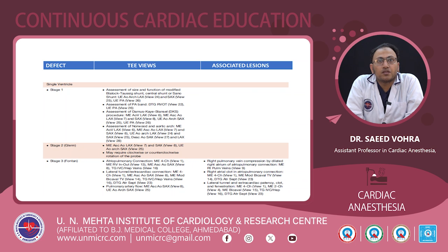To assess the DKS procedure, the mid-esophageal aortic valve long axis view and mid-esophageal ascending aorta long axis view and short axis view will be helpful. For the assessment of the Norwood and aortic arch, the mid-esophageal aortic valve long axis view, mid-esophageal ascending aorta long axis view and short axis view, and upper esophageal arch long axis and short axis view will be helpful. In stage 2 BDG patients, the mid-esophageal ascending aorta long axis view and short axis view, along with the aortic arch short axis view, will be helpful.